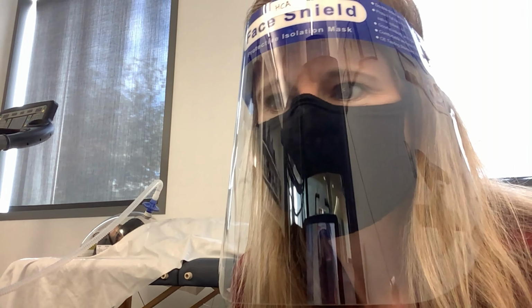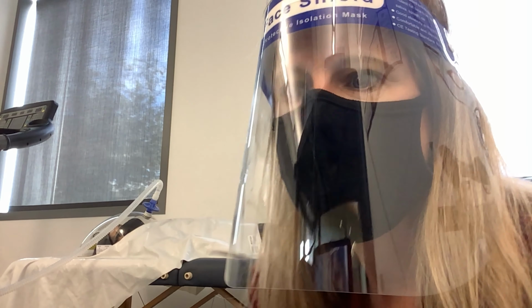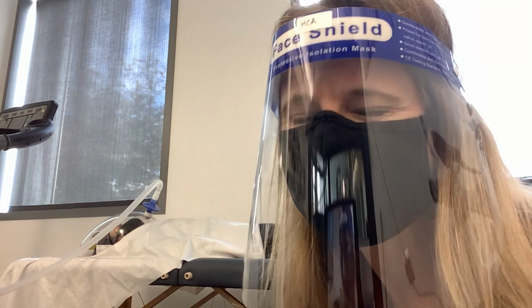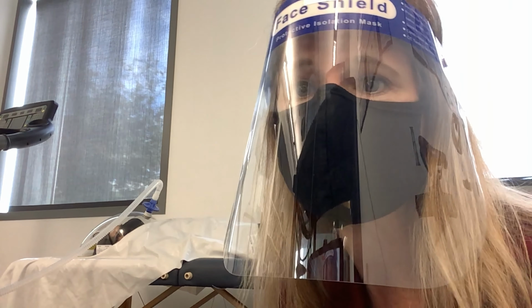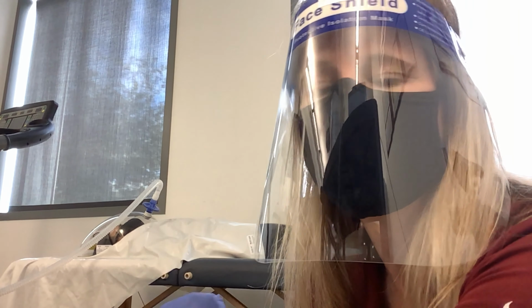Okay, we are about to begin our data collection of resting metabolic rate. Our client has been laying here on the table, resting quietly for about 15 minutes already. She rested for 10 minutes, and then I put the canopy and hood over her.